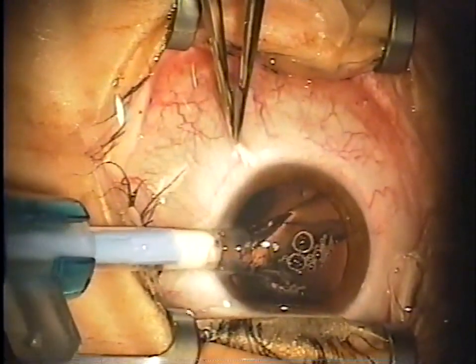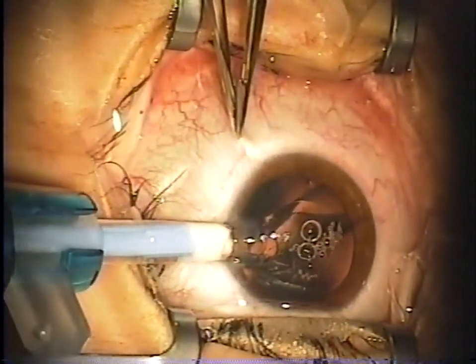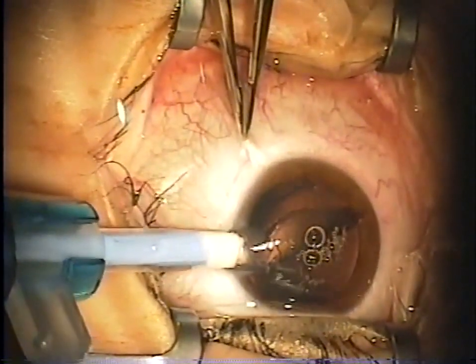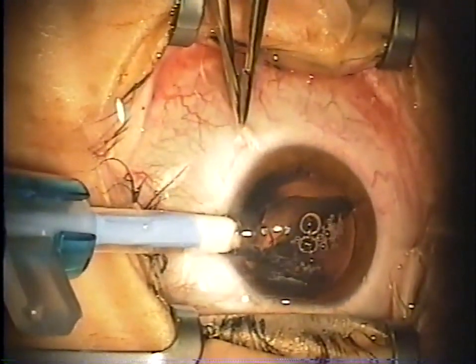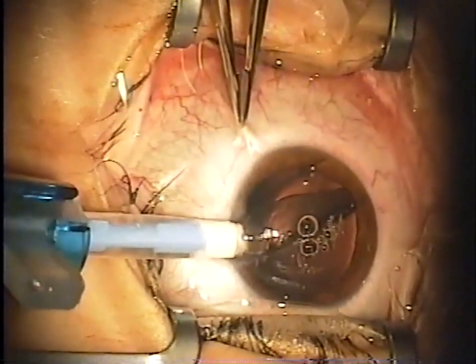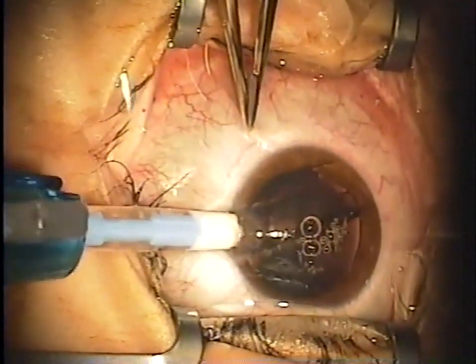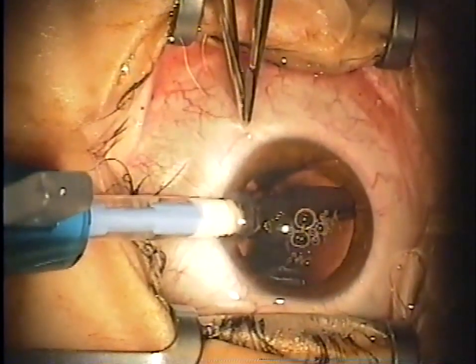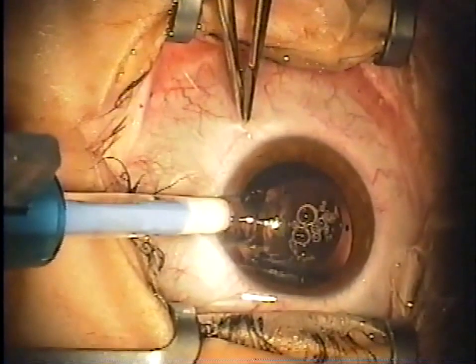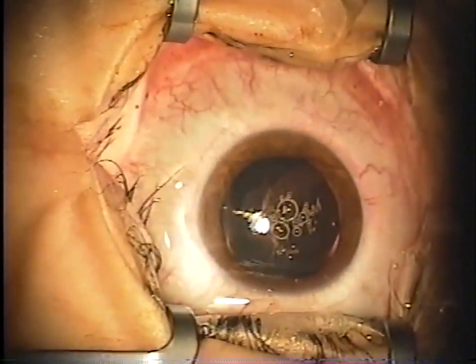You can see the superior haptic here has already unfolded. The inferior haptic is sticking to itself a little bit. These are loaded just like intraocular lenses with viscoelastics, so they sometimes are a little stubborn. Just a little gentle nudging, and eventually you'll see the haptic fold over here. You can rotate the injector as you need to keep the lens in the proper position, and you can see next to the optic there are some guide holes to help you determine where the middle of the lens is when it is completely rolled up.